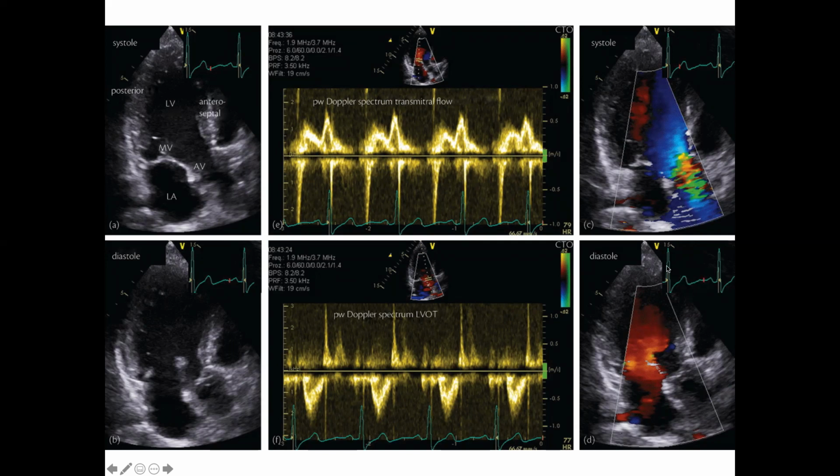So at this part of the ECG, this is where the heart relaxes and the mitral valve opens up and blood flows into the ventricle, right? And so it's coming towards the transducer in this, right? And we saw an example.